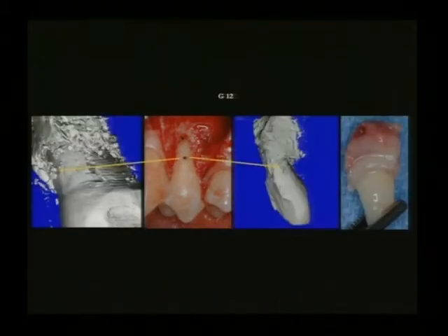Note, this is our micro-CT. So here's the tooth. You're going to take an x-ray of this tooth, a micro-CT. We're looking through it. Look at the new cortical bone growing down over the root surface. You can't see the notch at the alveolar crest because it's up here someplace. If we rotate the tooth around, that little dimple is that notch.